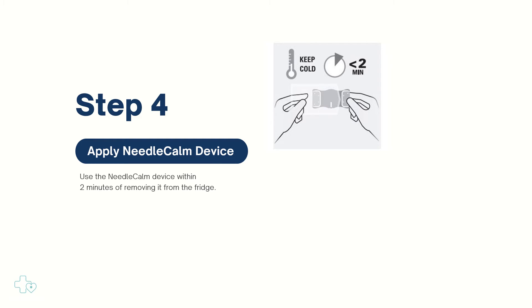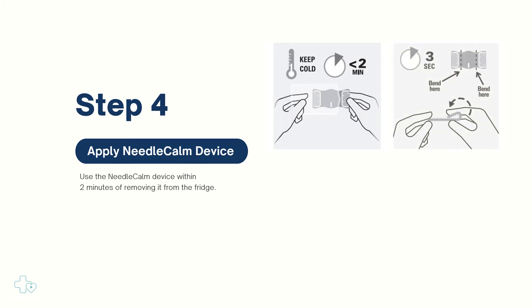Remove the pouch containing the Needle Calm device from the refrigerator, open the pouch, and remove the device holding the smooth surface. Pre-bend the device by folding one side inwards towards the middle and hold for three seconds. Repeat for the other side.